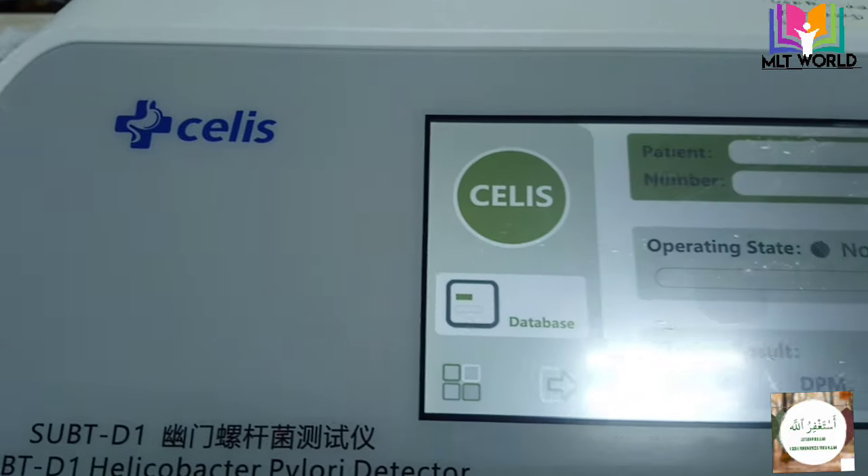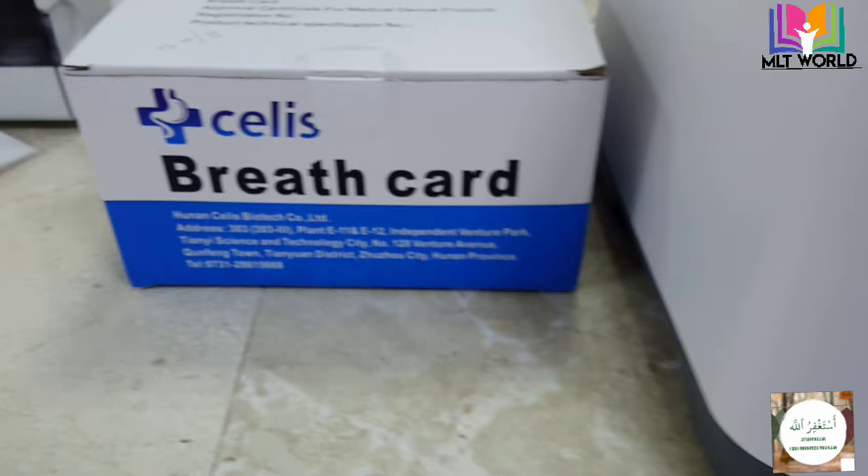Welcome back to MLT World. Today in this video I will show you how to perform a urea breath test.